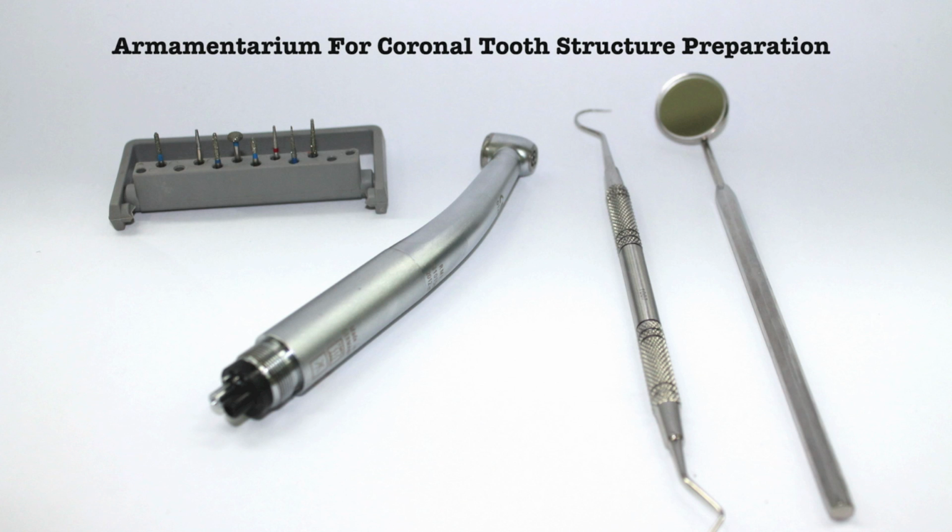Armamentarium for coronal tooth structure preparation: high-speed handpiece, mouth mirror, explorer, and diamonds.